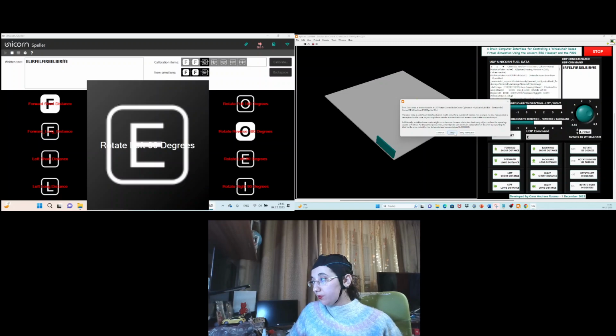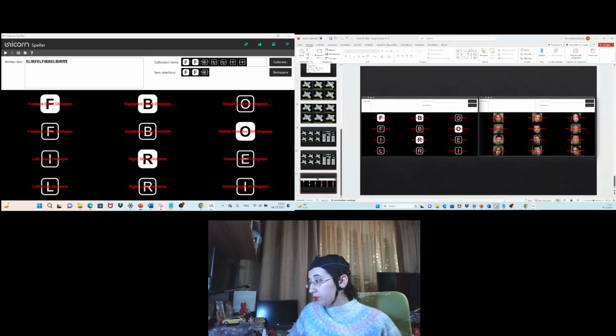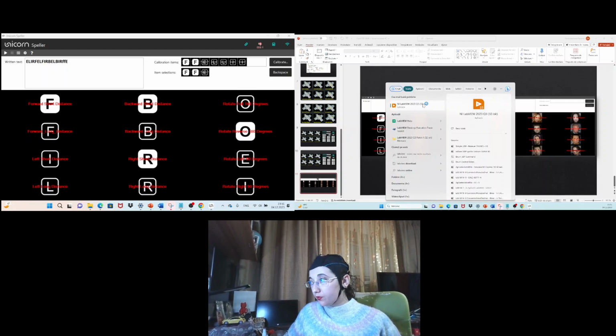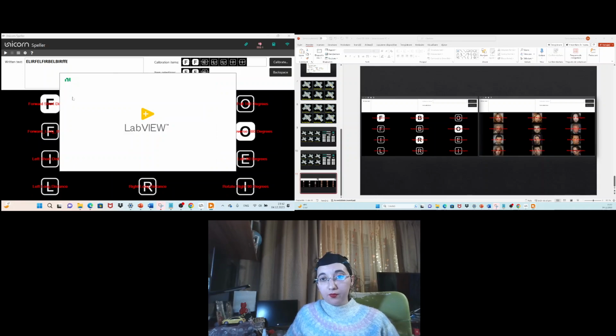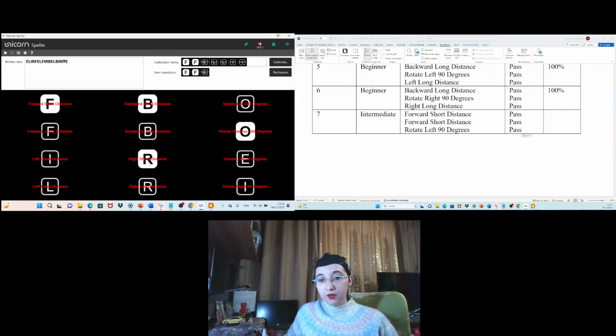It's okay, but so we have LLII. Fortunately, LabVIEW crashed. Yeah, maybe the 3D performance of my computer is not so advanced. But you could see that the first 3 results were also passed. Okay, let's restart LabVIEW and continue the experiment.